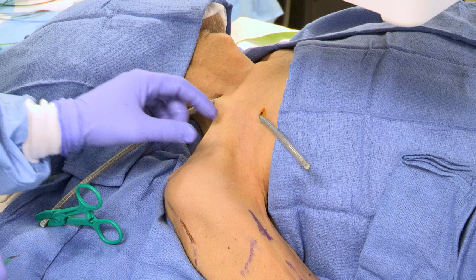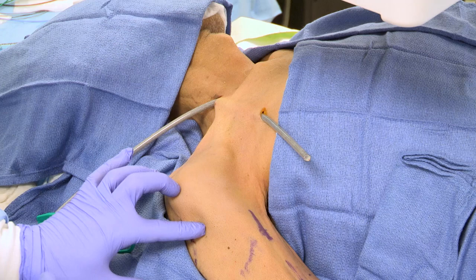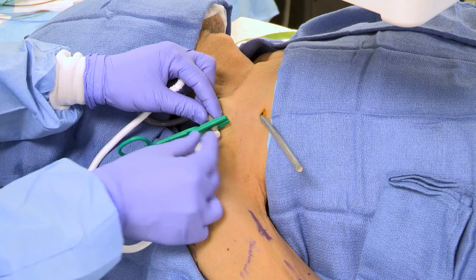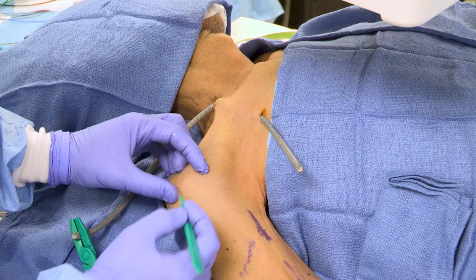The common teaching is that we make our incision in the infraclavicular space, and it's important that it's well away from the exit side of the catheter. More commonly though, I found that I like to put that over the lateral shoulder so that I have less motion. I worry that with arm movement there could be kinking in between the outflow component and the graft that's going to be connected to it. Over the shoulder, there's typically not any flexion that happens between the components.